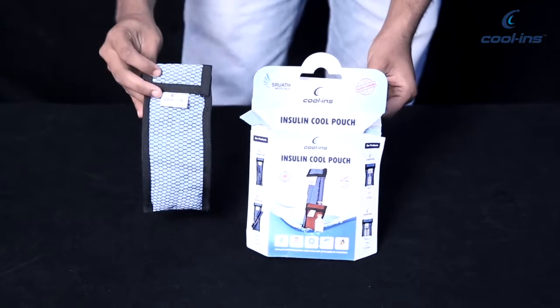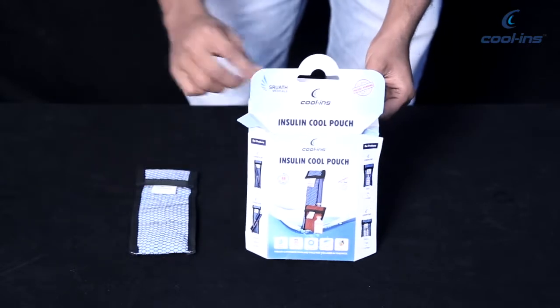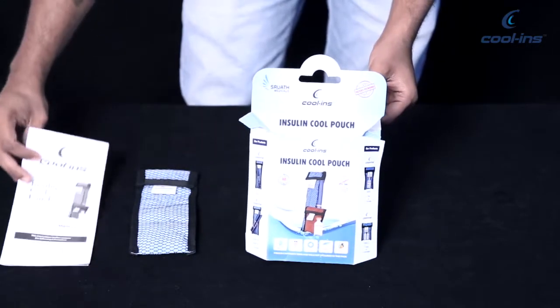Once you open the box, you will have to remove the Insulin Cool Pouch and a user manual. Please refer to the user manual before use.